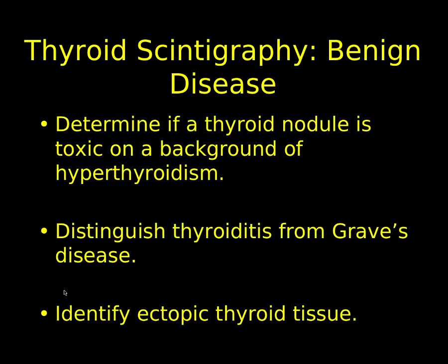In thyroiditis, the patient may be hyperthyroid, but when you give them the radioactive tracer, not a striking amount will be taken up by the thyroid gland. It'll either be normal or low. Whereas a patient with Graves' disease is hungry to take up as much iodine or technetium into their thyroid gland as possible and will concentrate that. We can quantify that by measuring the patient's radioactive iodine uptake, but we have to use iodine tracer to do that.